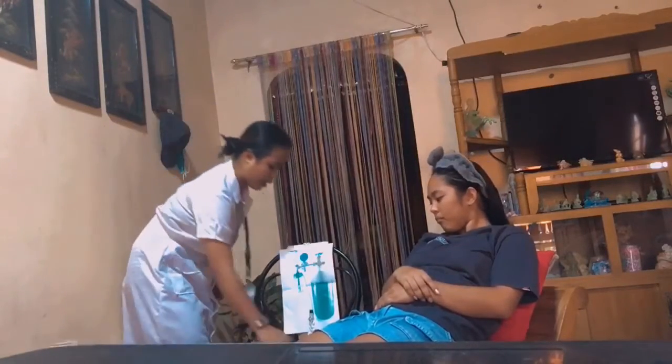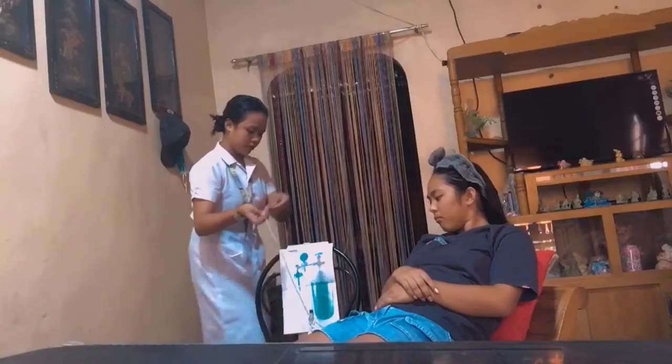So now we will put the cannula on our patient. Okay, so ma'am, lalagyan ko na po ito.